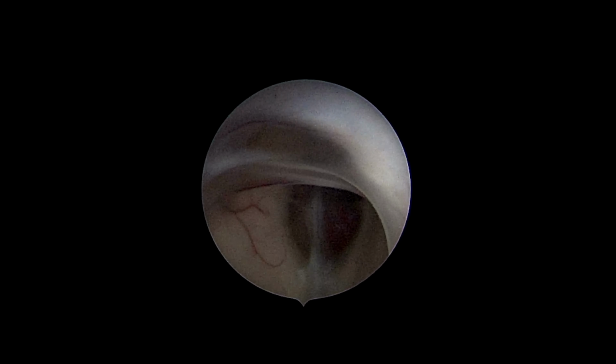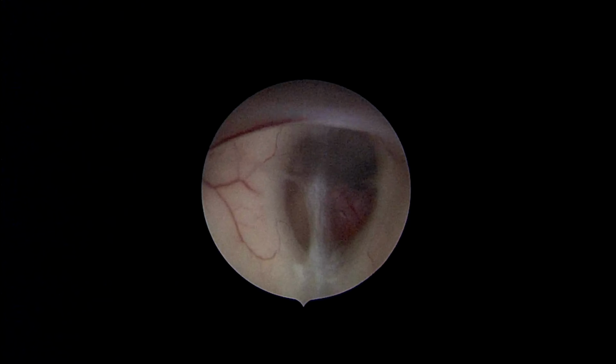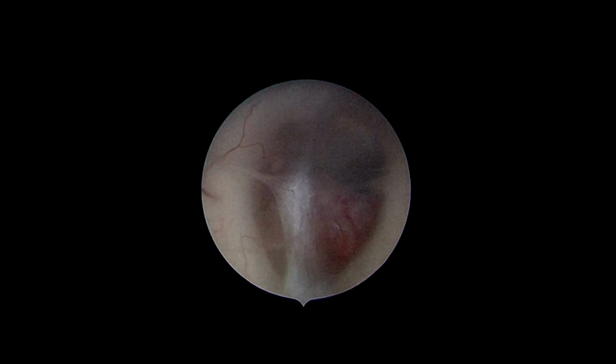This video is presented here as an uncut, unedited video. After identification of the foramen of Monro, we entered the third ventricle, where we can see the basilar bifurcation through the floor of the third ventricle and the dorsum sellae anteriorly. Here, the anterior part of the anatomy is on the top side of the video, and the posterior one is the down side of the video.